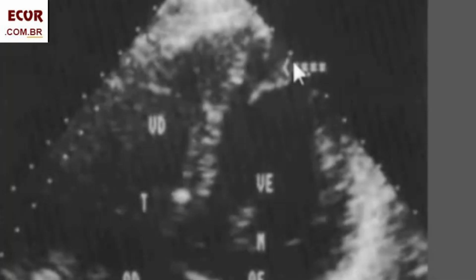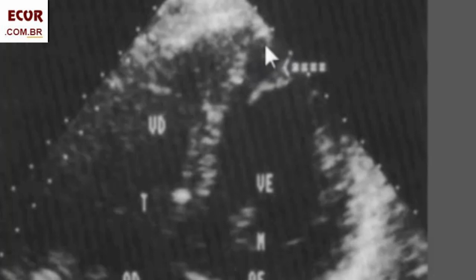Another common cause of mistake in this diagnosis is the presence of left ventricular trabeculations. Most of the time they are easier to differentiate since they have a trabecular or filiform aspect and usually don't look like a solid mass. There is always some space behind it with blood.